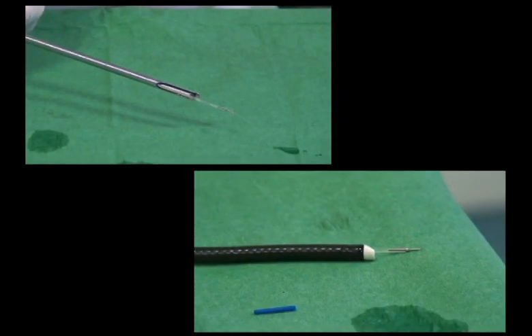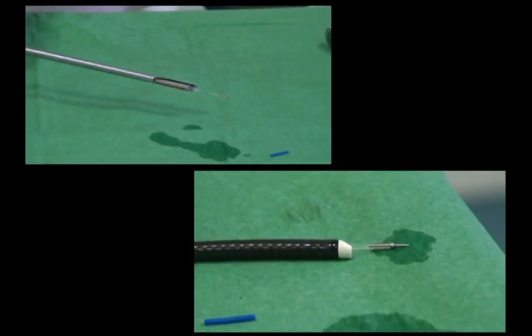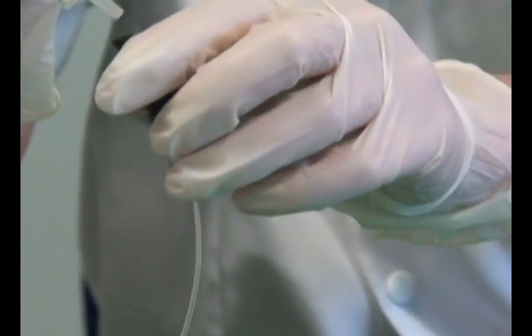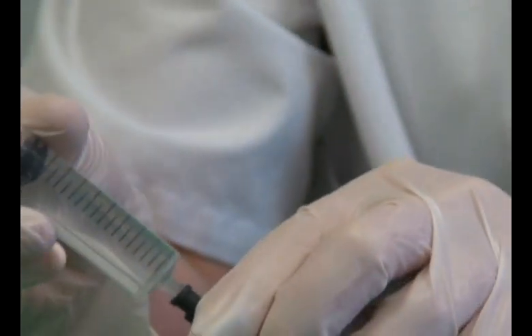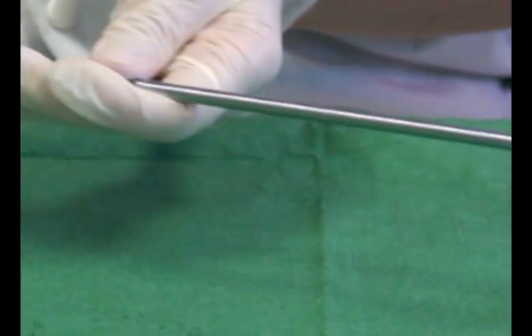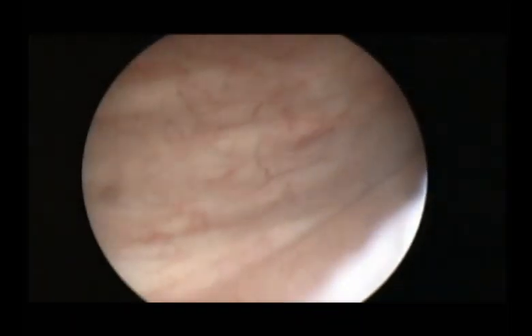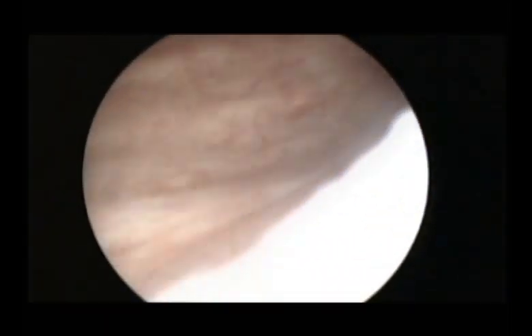Once we have the needle in the cystoscope, we first need to prime the air from the needle with 2 ml of saline water. We then connect the syringe containing the medication to the needle, lubricate the cystoscope and introduce into the bladder in standard fashion. Once we are in the bladder, we inspect it to visualize the trigone and the ureteric orifices, which will be spared during the procedure.